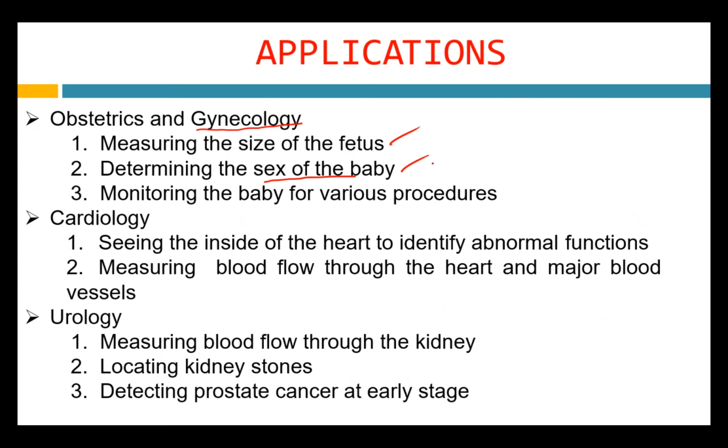So this is a boy baby or girl baby, they say it randomly, but in India it is banned. And if you want to know the baby's movement, or do some diagnostic procedures, you can do that by ultrasound. And in cardiology, as in gynecology, for initial screening of abnormal heart functions, they will definitely go for ultrasound.